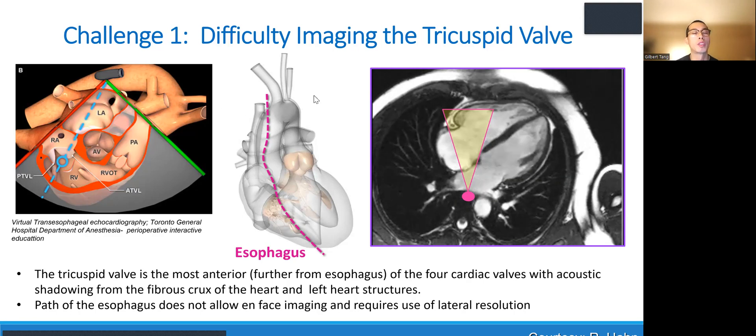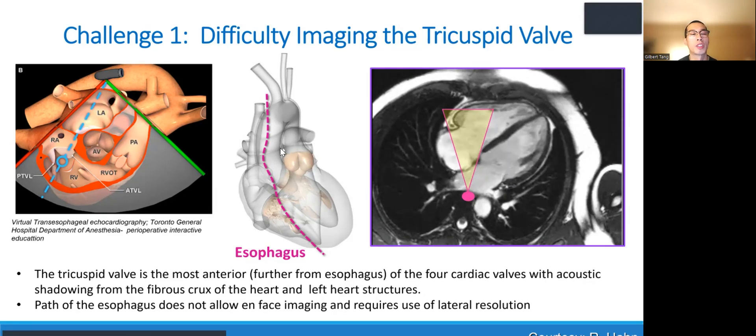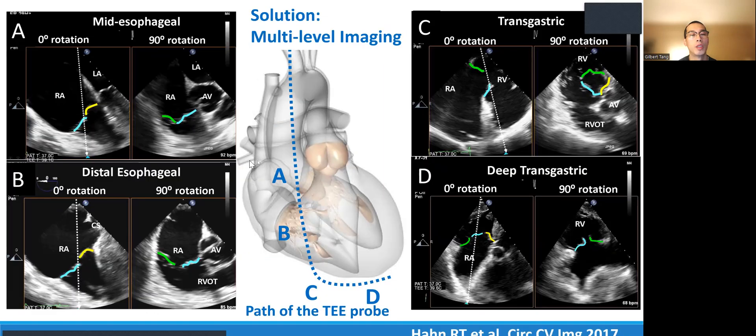There are a number of challenges imaging the tricuspid valve. The tricuspid valve is away from the esophagus, so you need to minimize acoustic shadowing from adjacent structures. You can see that the esophagus highlights the different types of tricuspid leaflets — septal illustrated in yellow, anterior in blue, and posterior in green — and how this will image differently as you go from zero degrees to 90 degrees, which is more of an inflow view.